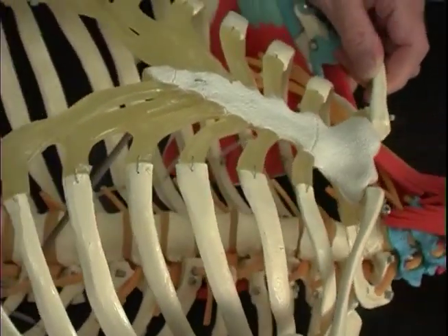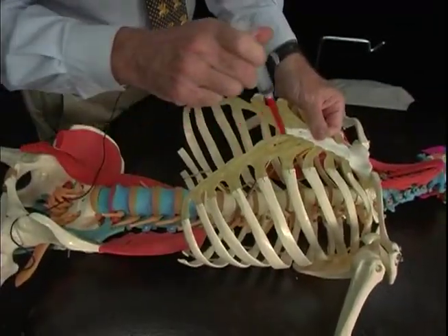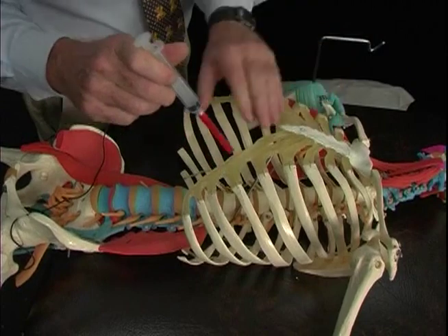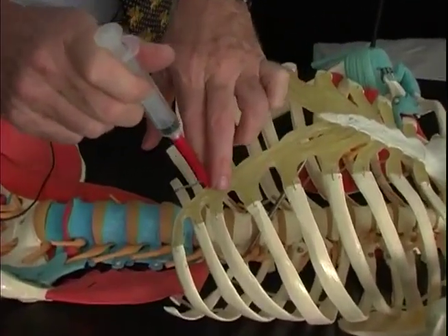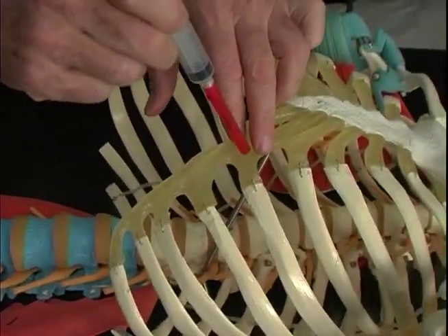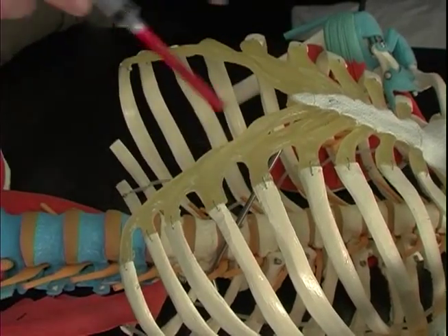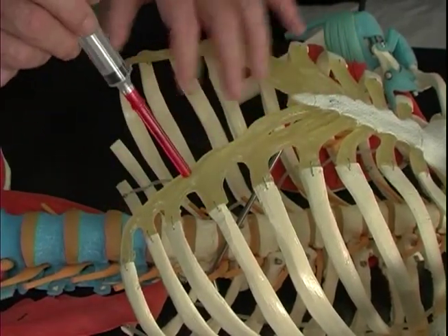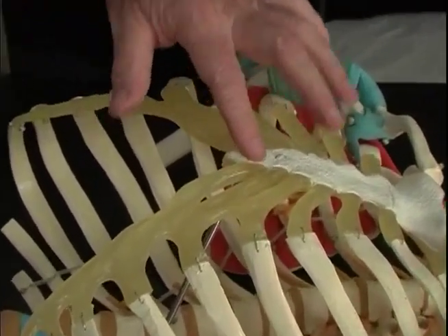When we get down into the lower rib cage, as we mentioned, the chondral area gets larger, with a rubbery feel to it, and we need to carefully do that and pepper that entire area everywhere it's tender. And I found that a real meticulous peppering of that does a much better job. We can also do the xiphoid if we wish, if that's tender as well.